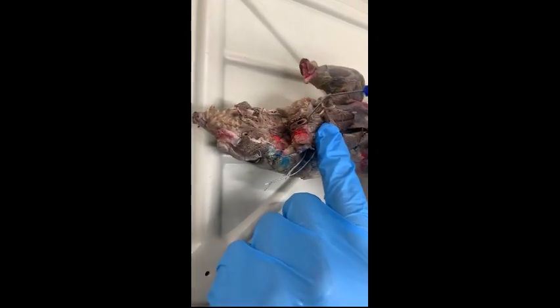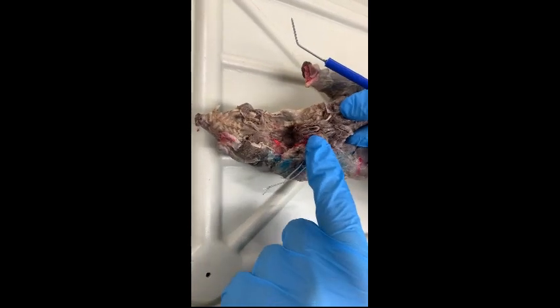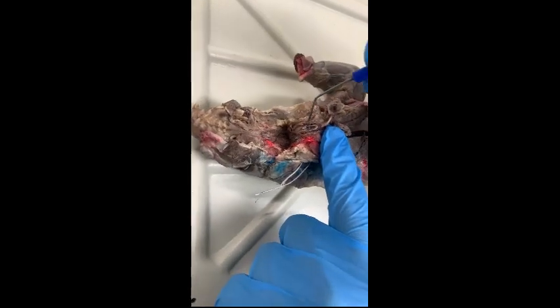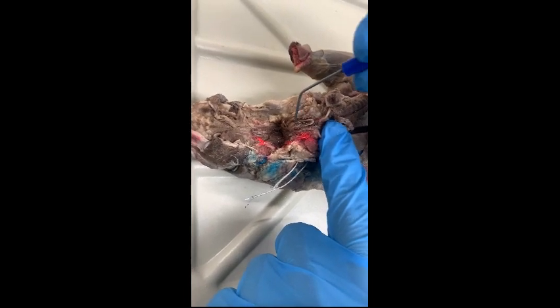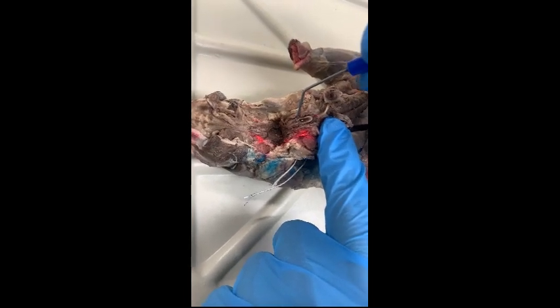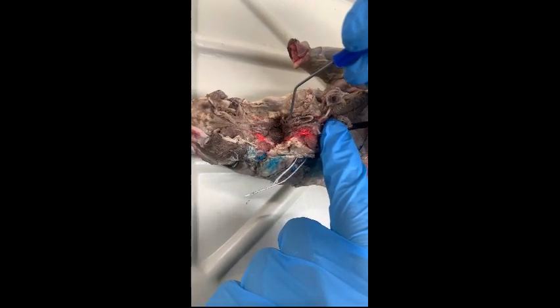This right here is going to be the entrance to our nasopharynx. As we look deeper, we can see that the glottis as well as the larynx would be right here, larynx being further in there, and underneath that would be the epiglottis.